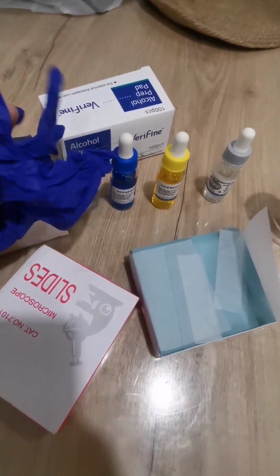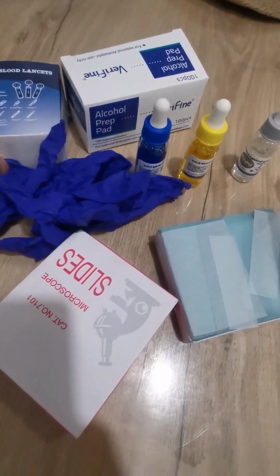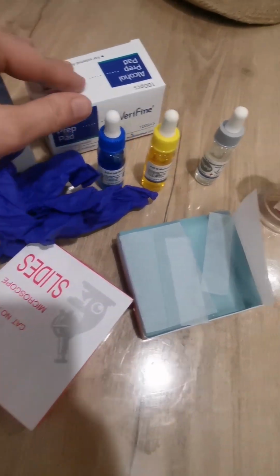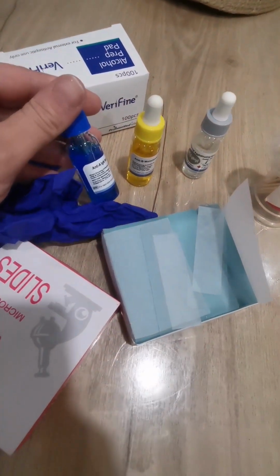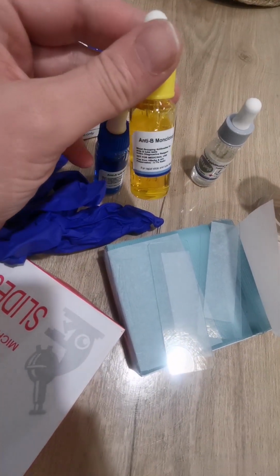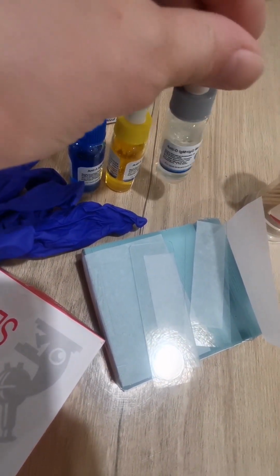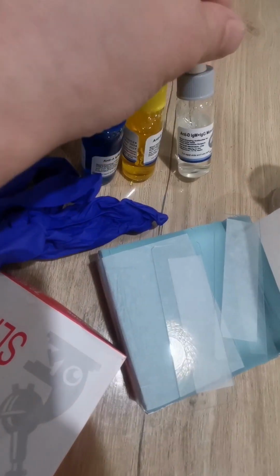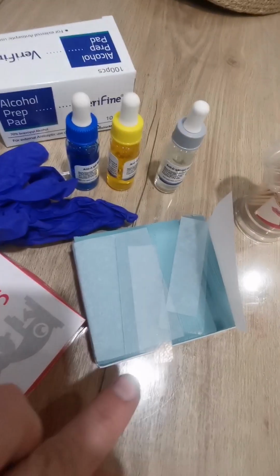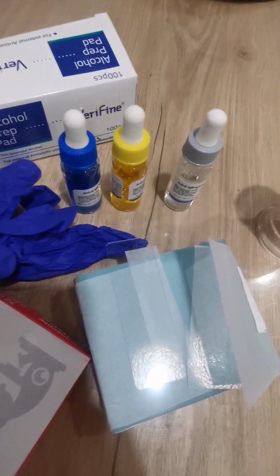Okay, to do the experiments to test the blood group, we need gloves, the blood lancet, and an alcohol pad. We need three solutions: the first consists of anti-A antibody, the second has anti-B antibody, and we also need anti-D, which is for RH, to determine if this blood group is positive or negative.